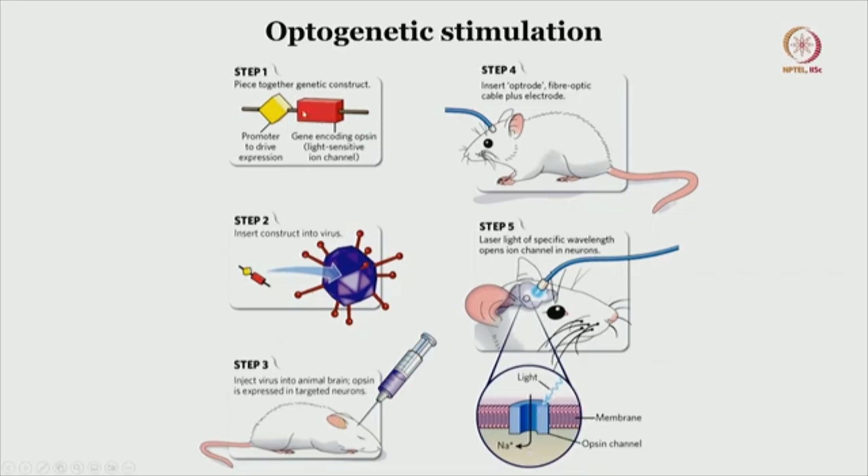So that particular viral genetic construct needs to be inserted into the virus. Once that is done, then the entire viral vector is instilled into the same target that we just discussed in the first few slides, wherein the Hamilton syringe has the viral vector which will be implanted first, alright.